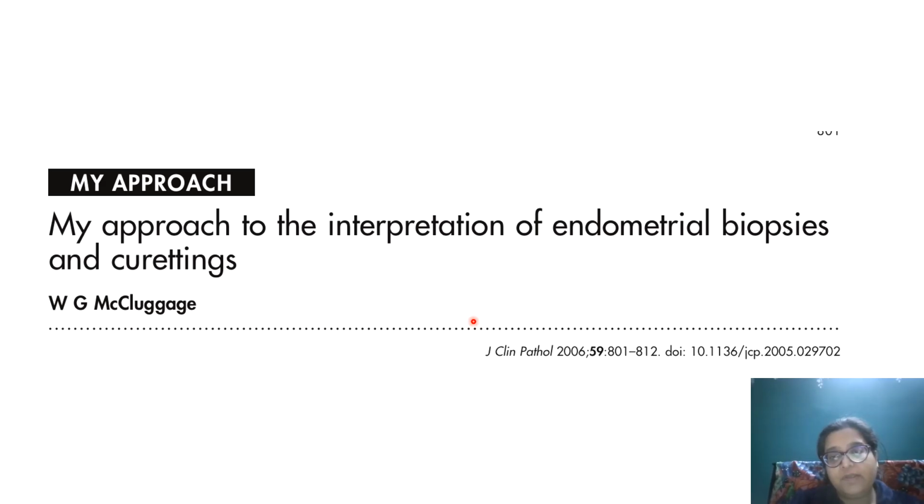So this is the paper. I have just touched some points. They have talked about pill endometrium and hormonal changes. When you label something as a disordered endometrial proliferation, that is a precursor to hyperplasia, then atypia. Disordered has approximately 10% cystic changes in the gland and telescoping and some focal area of back to back glands or hyperplasia. Pill endometrium will show a lot of gland breakdown, stromal breakdown, maybe no telescoping and less than 10% cystic area. If you're taking a lot of progesterone, the stroma might show a lot of deciduoid changes.